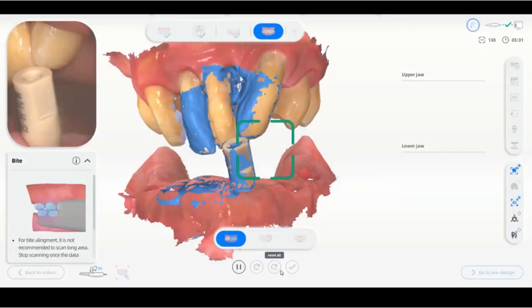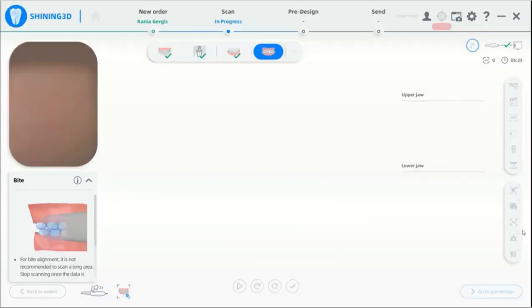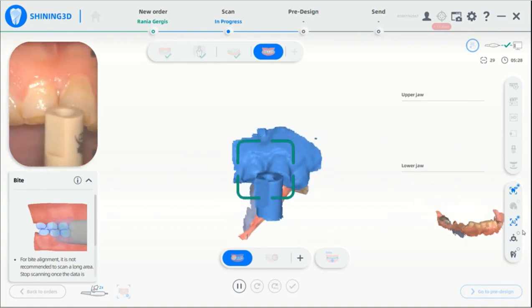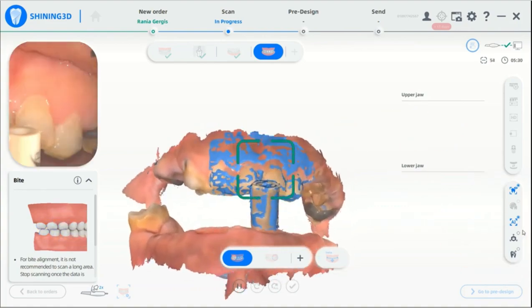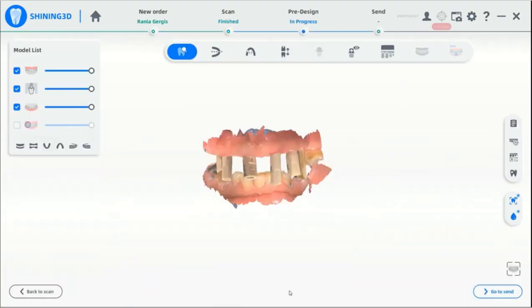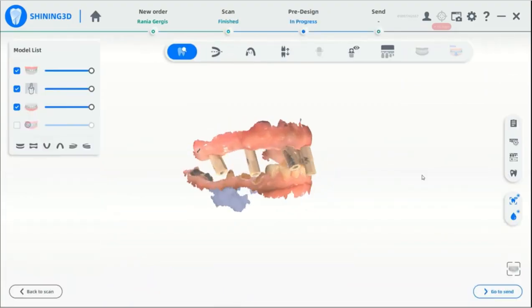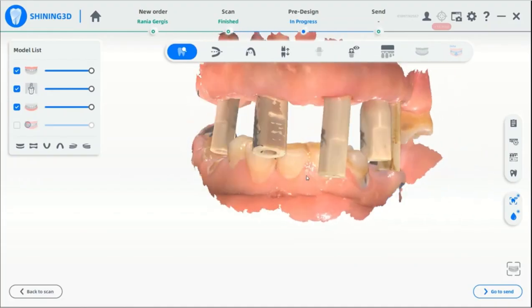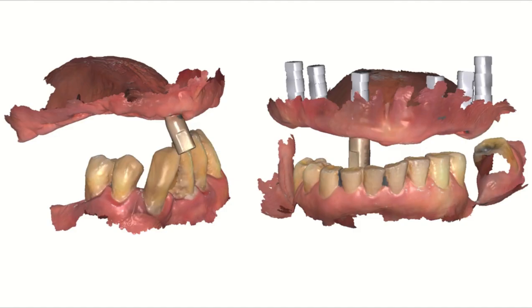Here, the scan body acts as a stopper with the opposing teeth. Look how the scanner in this video captures the bite easily in the correct vertical dimension of occlusion. Of course, there are a lot of guidelines that should be respected in this technique, which we are going to uncover in our new article. We recommend intraoral scanners with high depth of field and wide field of view so you can register the jaw relation of these tough cases, the maxillary and the mandibular arches in their relation.